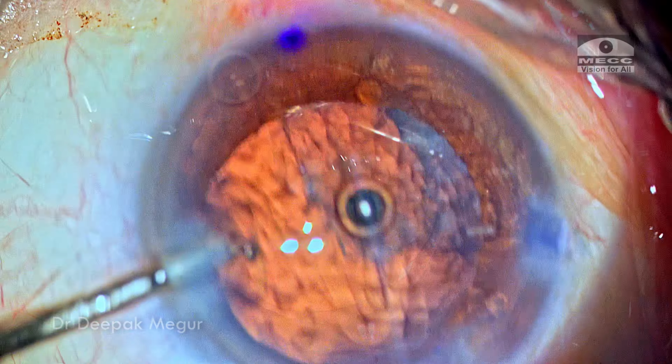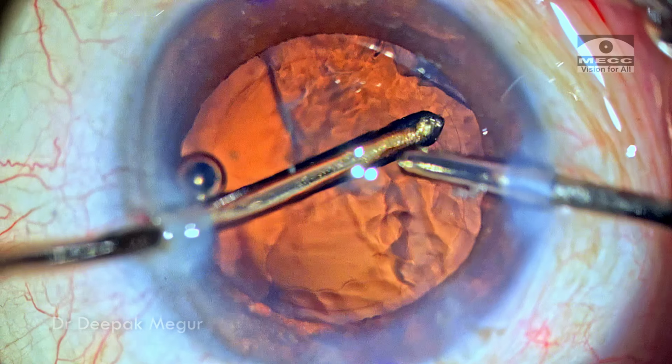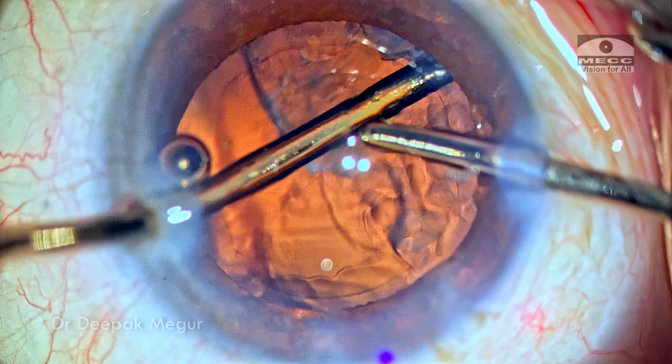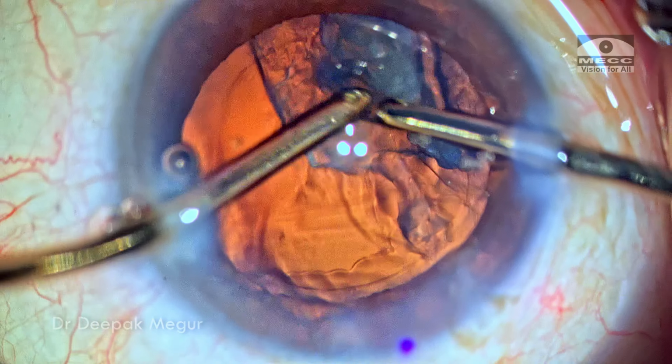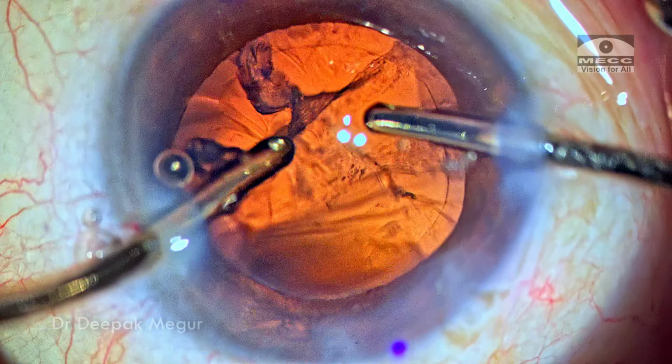For me, the best strategy is always to go in with a very low bottle height, and then once the aspiration begins, gradually increase the bottle height. This minimizes the sudden stretching of the ciliary body, and definitely the patient is much more comfortable.